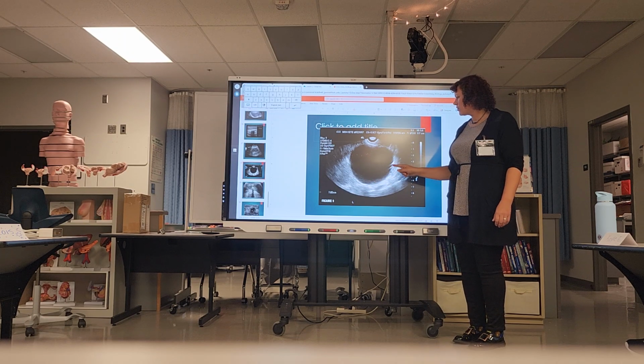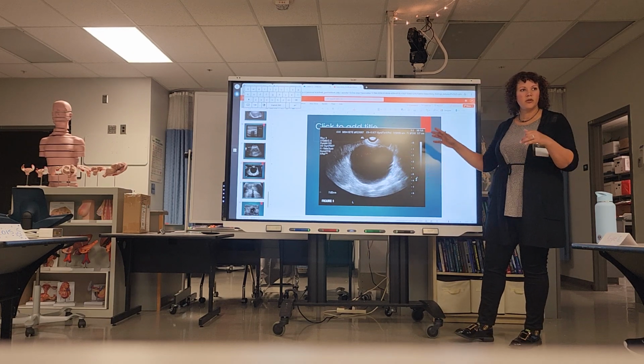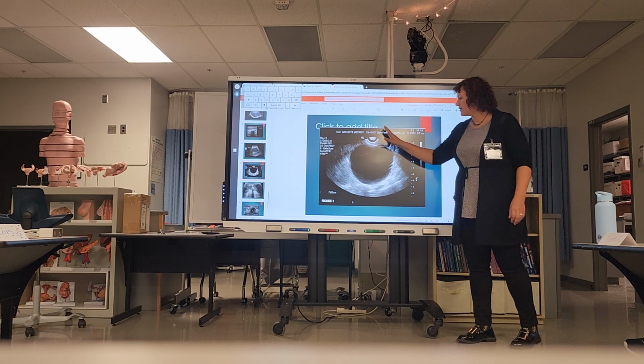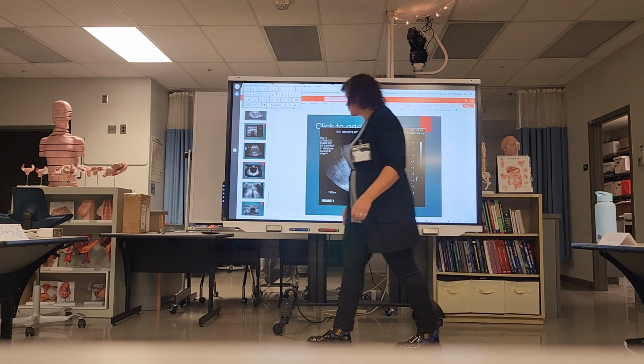So we want to make sure that our cystic structures do in fact look cystic. You'll adjust your gain, you'll adjust your TGCs to make sure that it doesn't look like there's any echoes in that cyst, if it is truly simple.